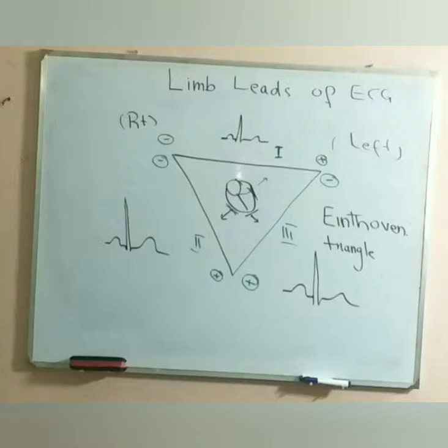because every lead is behaving like a camera which is recording the event simultaneously. If you have got certain cameras fixed around you and you are trying to talk, every camera will pick up from its own angle, but the event would be the same, though the picture can be a little bit different because of the deviation of the angle. So lead 2 was looking at here, lead 3 was looking at here, but this area went uncovered. Same was true with this area, because lead 1 was picking up the electrical activity of this part of the myocardium or the heart, and lead 3 was picking up electrical activity from this part of the heart. So these uncovered areas were dealt with later on.